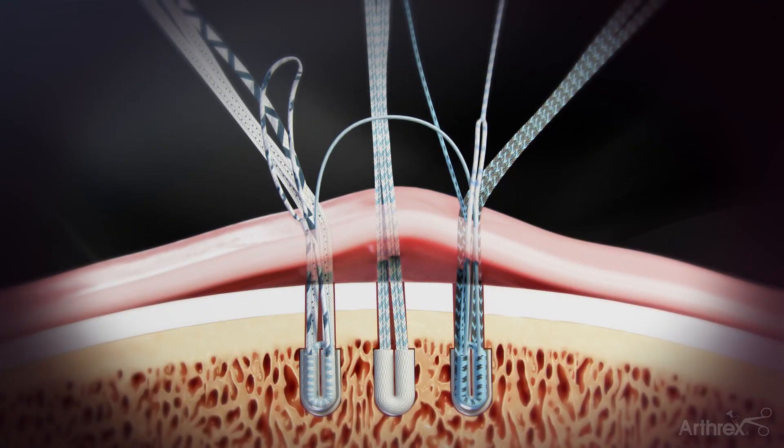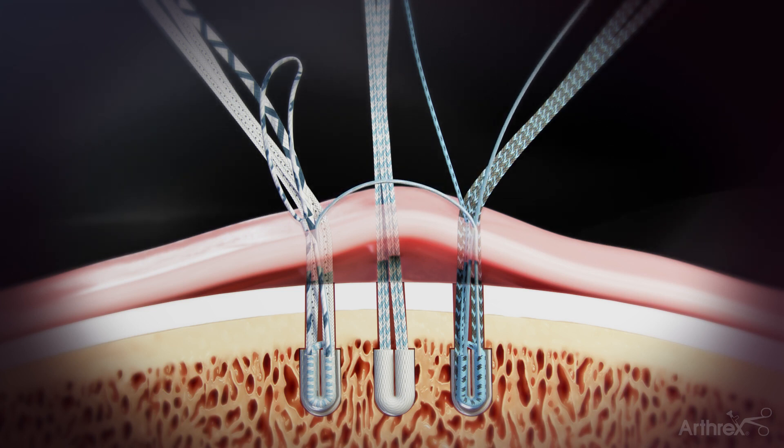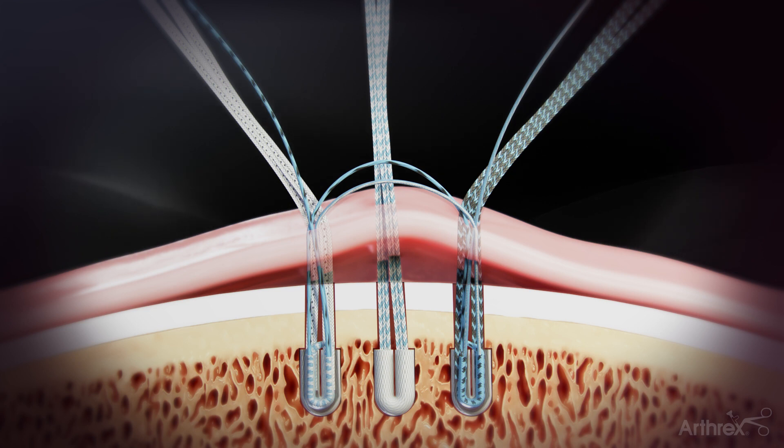Pull the suture tape tail of the anterior shuttle link to shuttle the repair suture into the knotless mechanism. Repeat the previous steps using the anterior repair suture and the posterior shuttle link to interconnect the two anchors, completing the medial pulley ripstop.